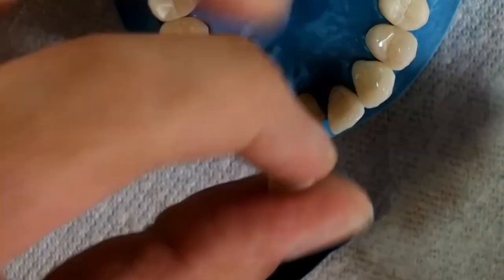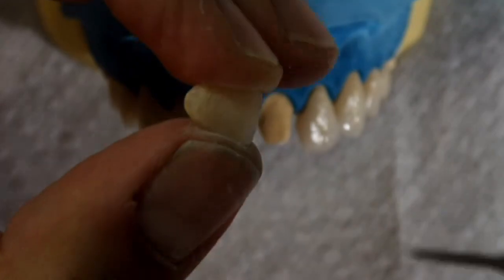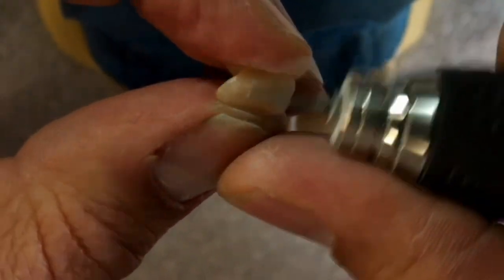In this video, we are going to focus on the shape of the part of the tooth that you can see in the mouth — the clinical part. This video is all about looking at the basic shape of the tooth crowns. We're going to use the front teeth as an example, but the same idea applies to other teeth in the mouth.